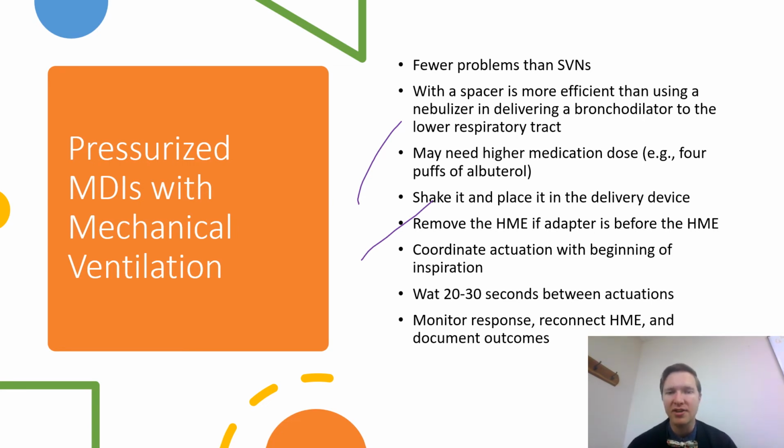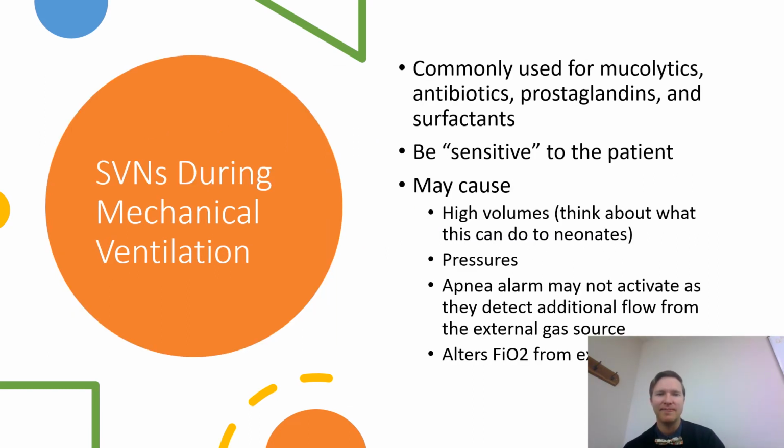Wait 20 to 30 seconds between actuations, right? Allow for that medication to redistribute in the container there. And then monitor the response, right? Make sure their heart rate's not going up. Make sure nothing else is going crazy. So make sure you've given all your 4 puffs. Monitor the response, reconnect the HME, and then document. Like I said, most of our career is documentation, but document that outcome once you're done with it.